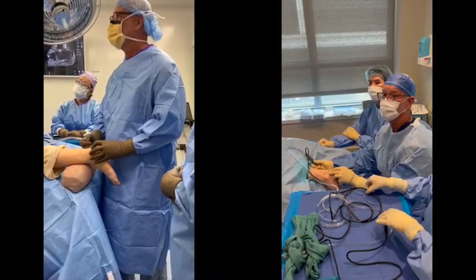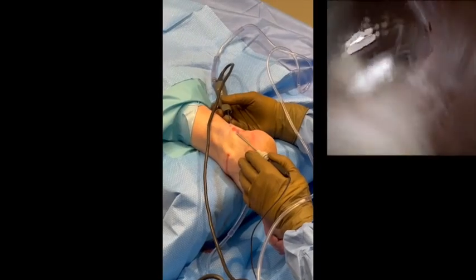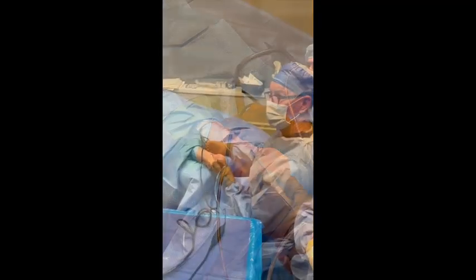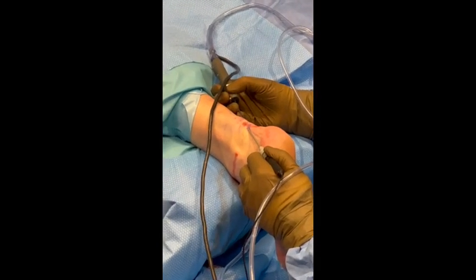This procedure can be performed in both the office setting and in a formal operating suite. Benefits of using a 1.9 mm endoscope include: the smaller diameter of the endoscope reduces the trauma to the soft tissue envelope, thus reducing the risk of wound complications and facilitating rapid return to work, activity, and sport. There are limitations associated with the 1.9 mm endoscope, as currently no 30-degree endoscope is available.